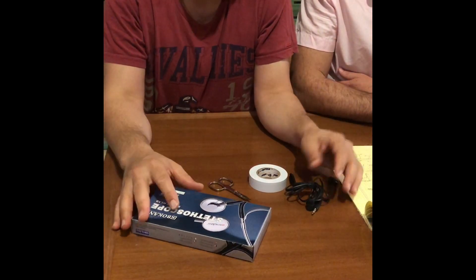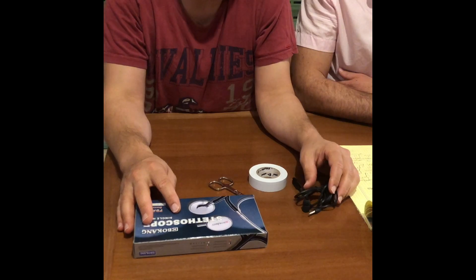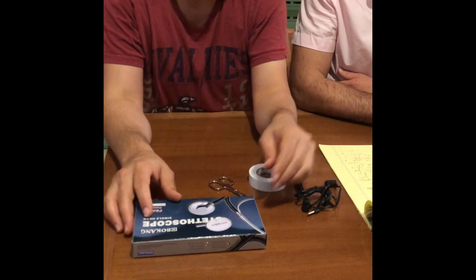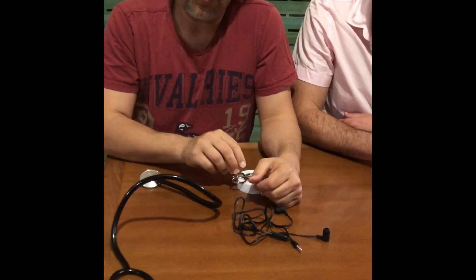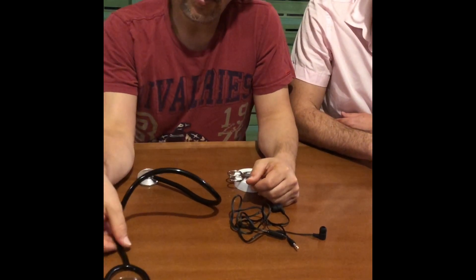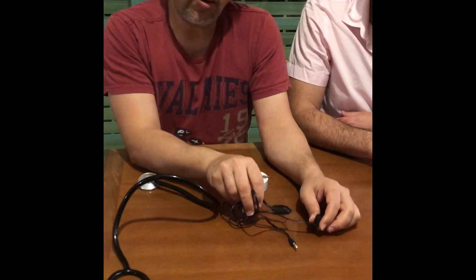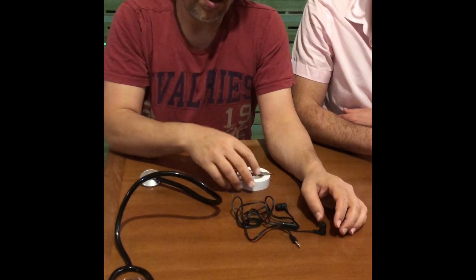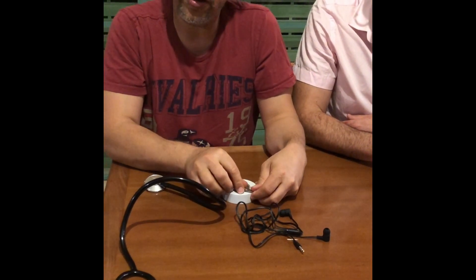Our solution is easy. All the equipment together that we use here costs no more than ten US dollars. The solution is based on an inexpensive stethoscope, earphones with a microphone, and a bit of tape and scissors. That's all what we need here.